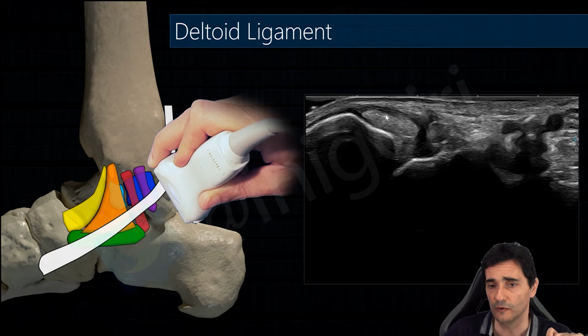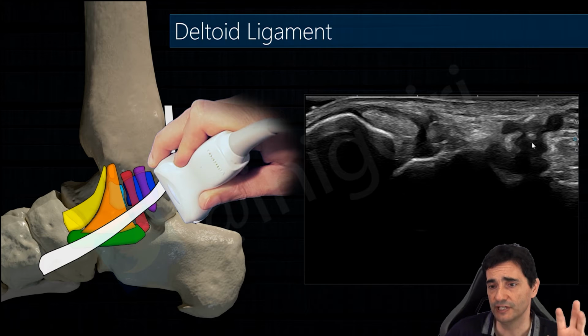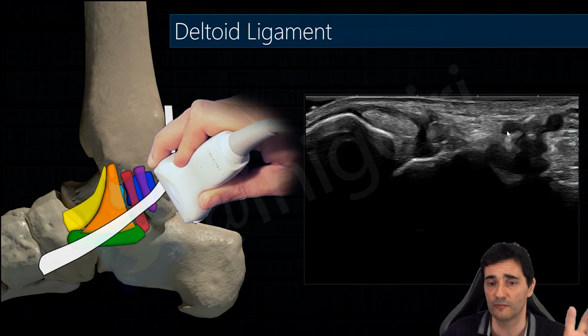Usually, if you have a good view of the posterior tibialis tendon, you should have a worse view, a bad view of the flexor hallucis. And if you're not sure, you need to tilt the probe, with this anisotropy, to locate the flexor hallucis longus below the sustentaculum tali. Okay, and to finish, just remember that these are the vessels with the artery and veins, tibial posterior artery and veins, and the tibial nerve, which usually divides into three branches.